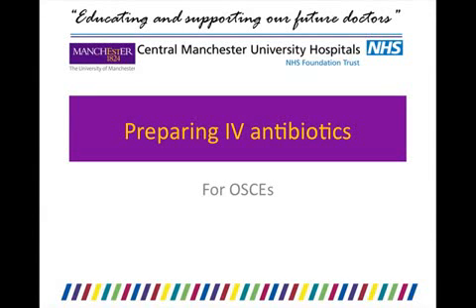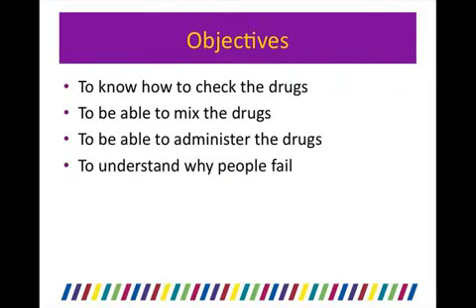Welcome to this short video on preparing IV antibiotics for OSCEs. The objectives are to know how to check the drugs, to be able to mix the drugs, to be able to administer the drugs, and to understand why people fail this station. The first thing to say is that it's difficult to predict what would come up at this station, what type of antibiotics, so this video is just giving you an overview.